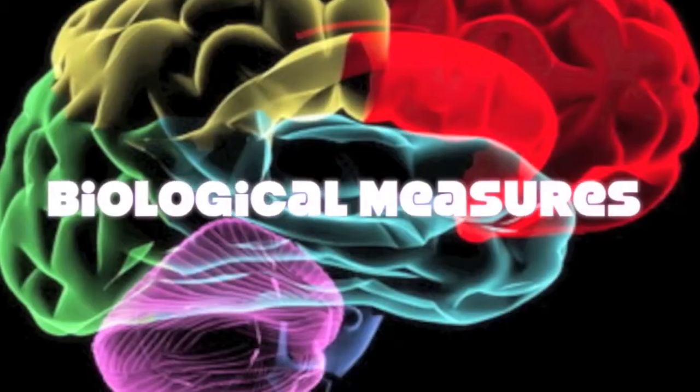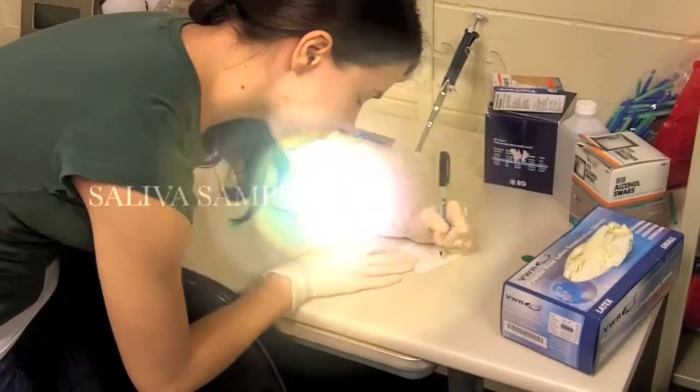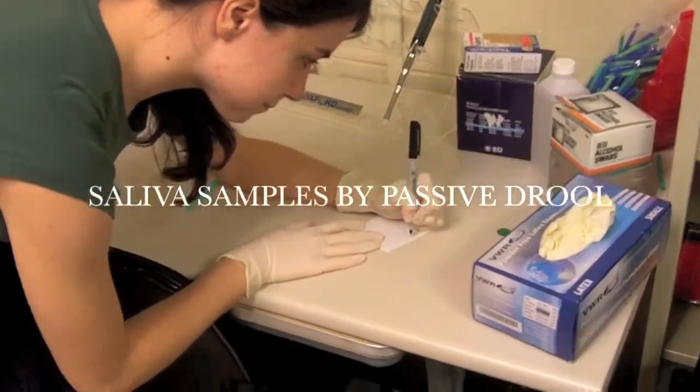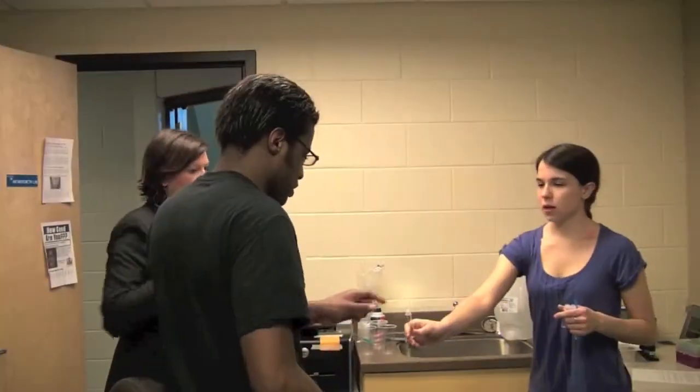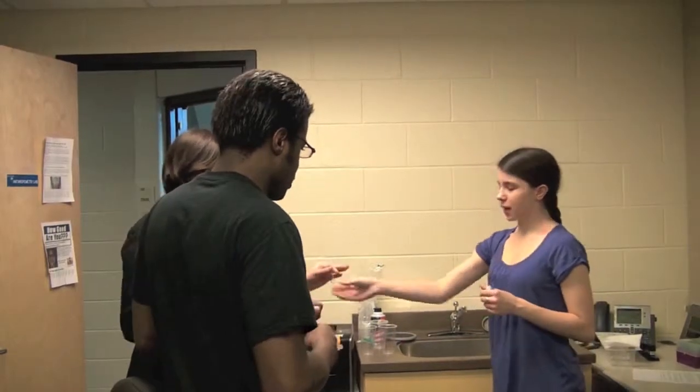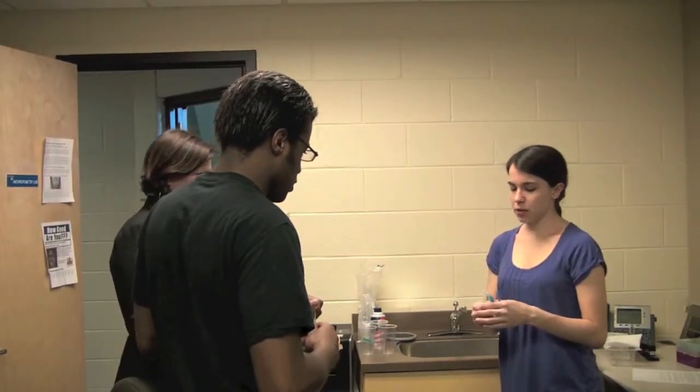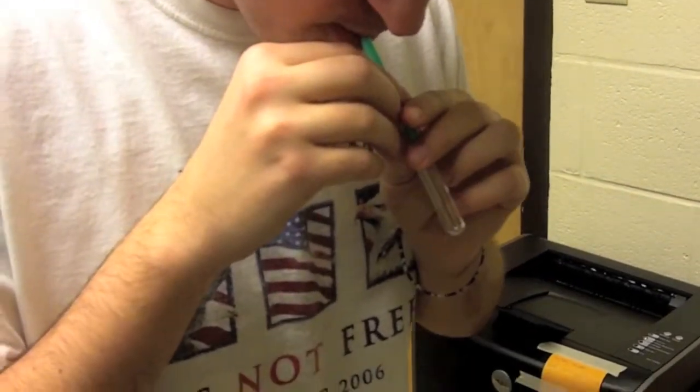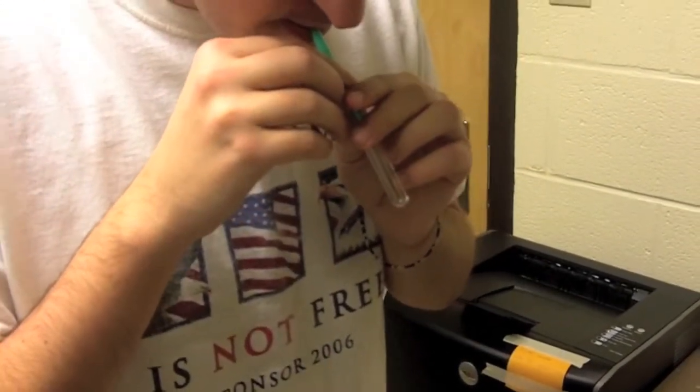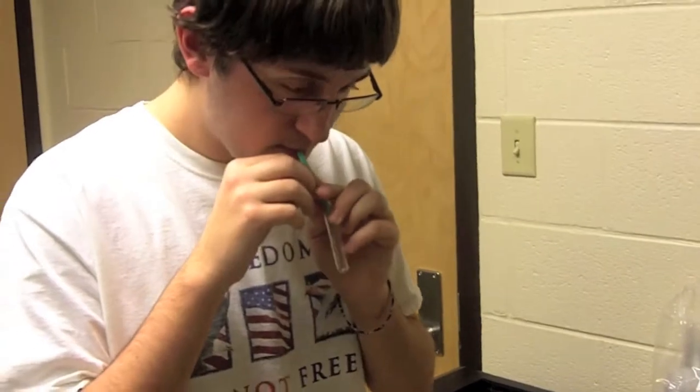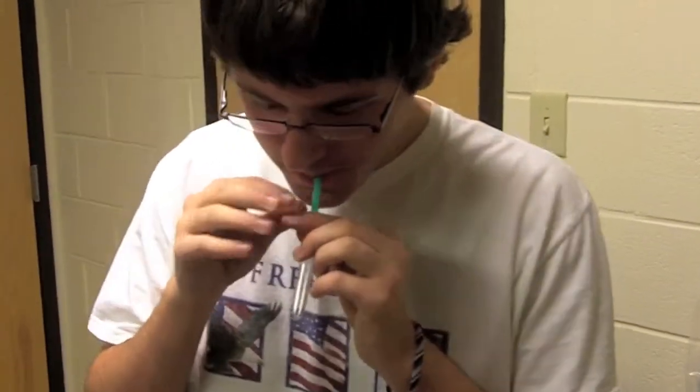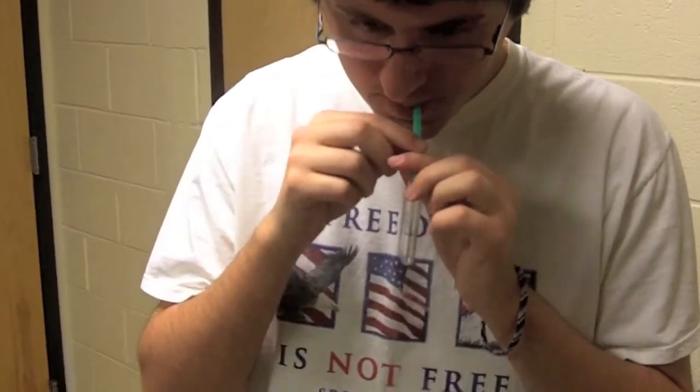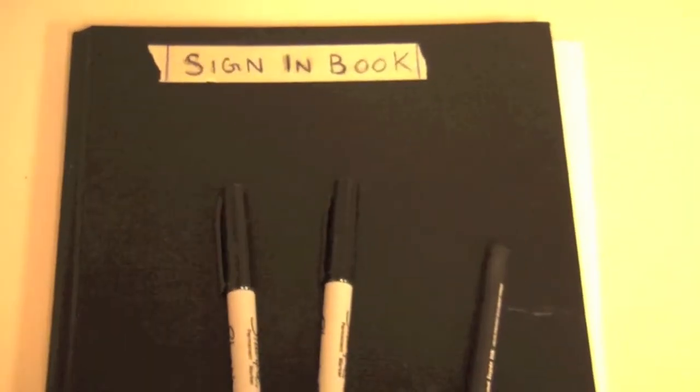Biological Measures: Collecting Unstimulated Whole Saliva Samples by Passive Drool. Let's begin by learning how to collect saliva. In this portion of the video, we will review the protocol for collecting unstimulated whole saliva samples by passive drool. Two samples of saliva will be taken from each participant. The first will be collected at the beginning of the session, and the second will be collected at the end.